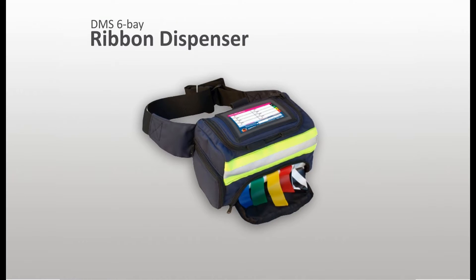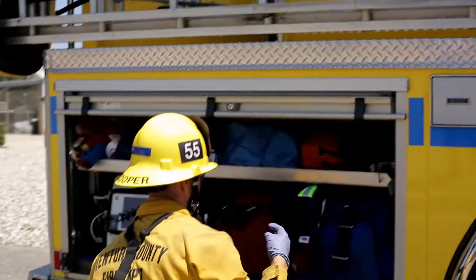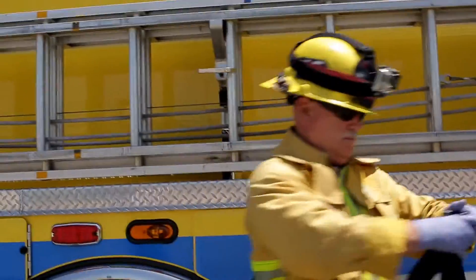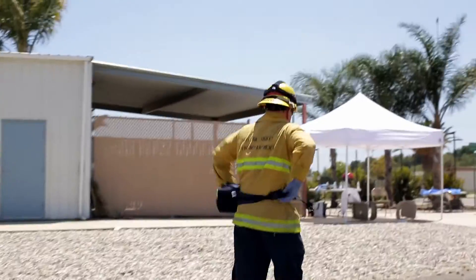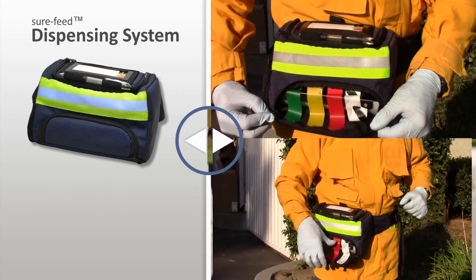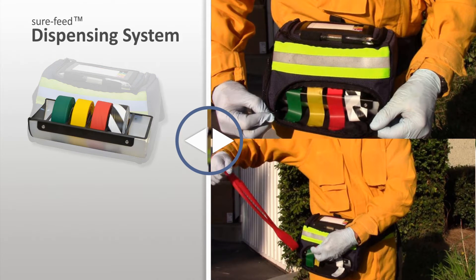By design, the Disaster Management System six bay ribbon dispenser provides responders with the features and functionality required to optimize the initial triage process. Developed from years of field experience, the dispenser system was engineered to overcome the critical points of failure inherent in other designs. Reliable dispensing is at the core of the system's design, achieved by utilizing a dedicated dispensing bay and integrated ruggedized tray to ensure ribbons feed reliably in any environment.